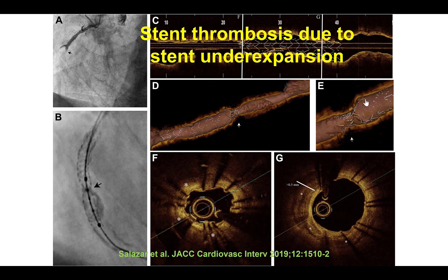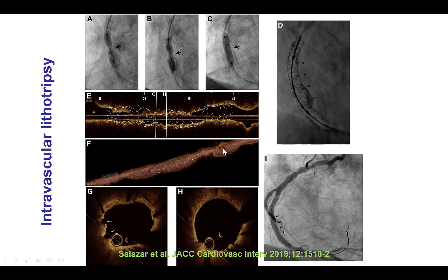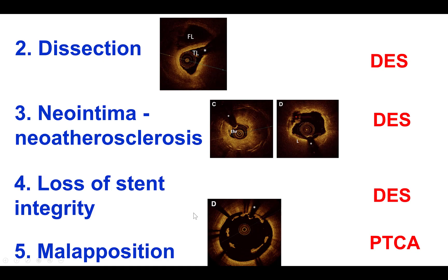This is another patient who presented with acute stent thrombosis in the setting of stent under-expansion. This can be seen using stent boost technology as well as with optical coherence tomography. The stent could not be expanded with high-pressure balloon inflations; however, a lithotripsy balloon was used which successfully expanded the stent, as seen both angiographically and by optical coherence tomography.